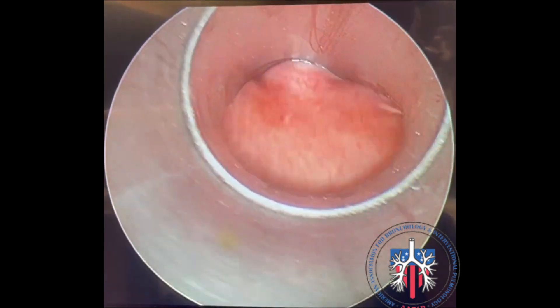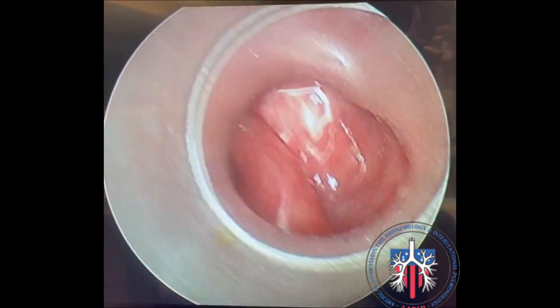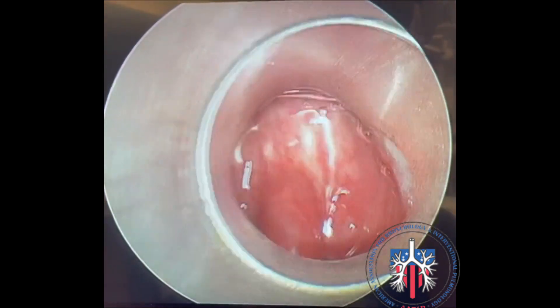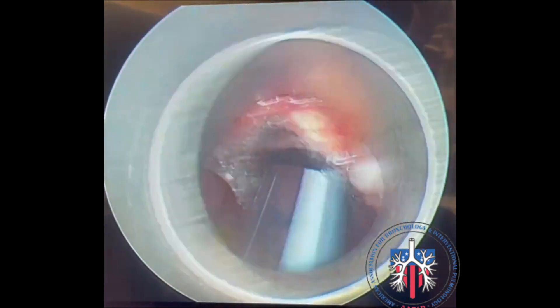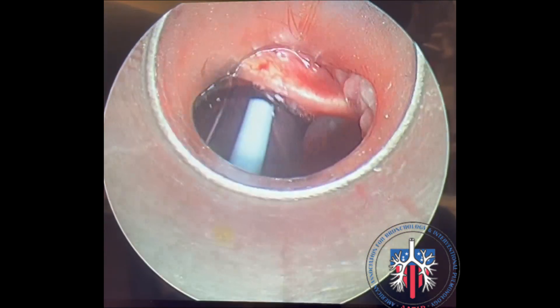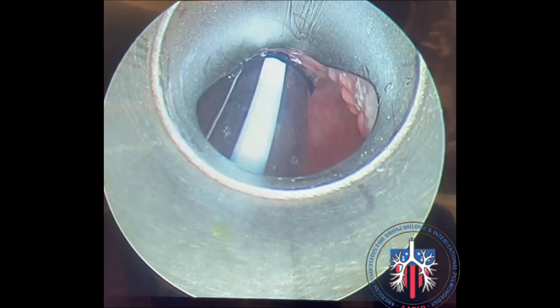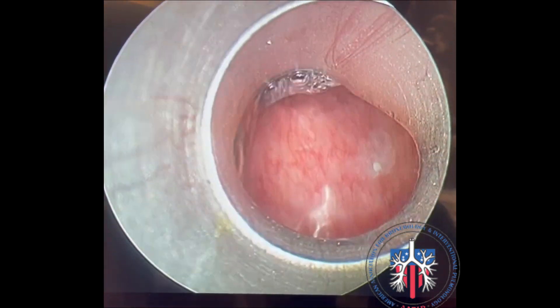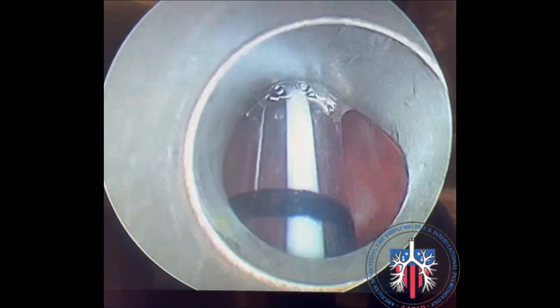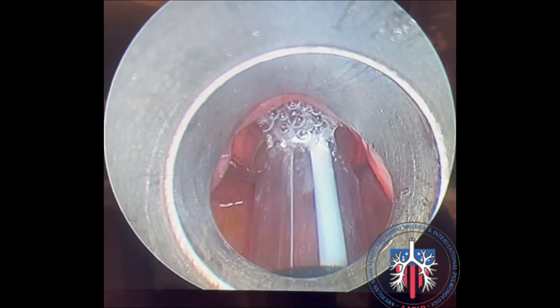Introduce the rigid scope lateral to the endotracheal tube and find the uvula. Slide the rigid scope directly on top of the tube until the epiglottis comes into view. Lift the epiglottis and advance the scope.